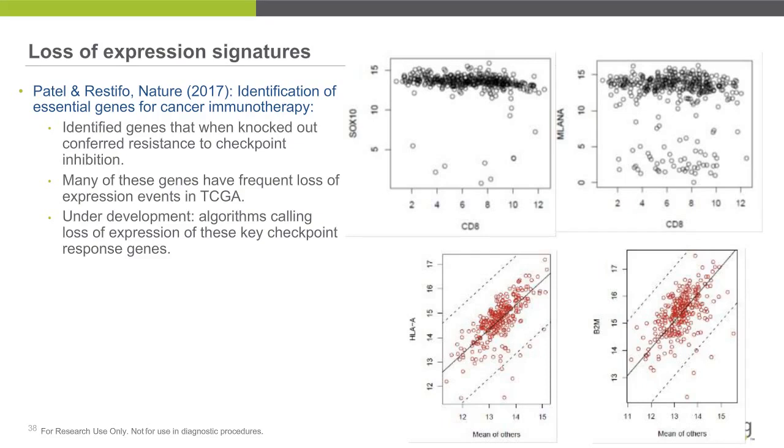And however you perform across the immune hot cold spectrum, there's information to be gained from the tumor inflammation signature. And I would hope lots of information to be gained from these other signatures. There are diverse mechanisms of resistance to immunotherapy, and we think we can capture a great many of them with gene expression.